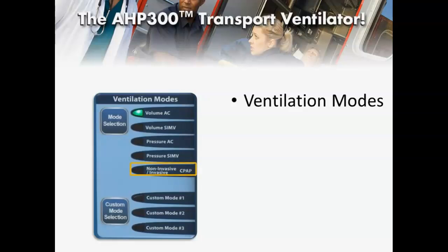Below these selections, you will notice 3 custom modes. These are additional rapid recall settings that function like the quick start modes in that they allow the user to quickly recall previously saved ventilation protocols. Again, we will cover this in the special features section.